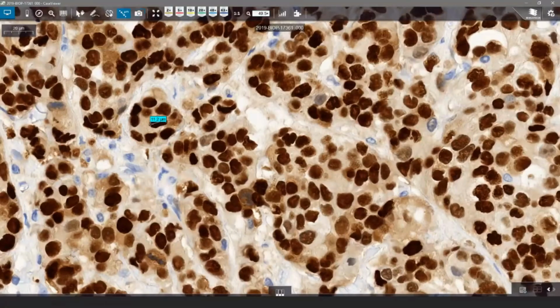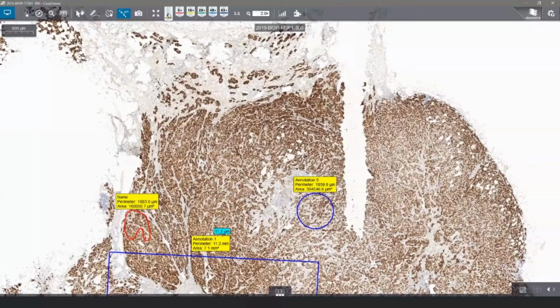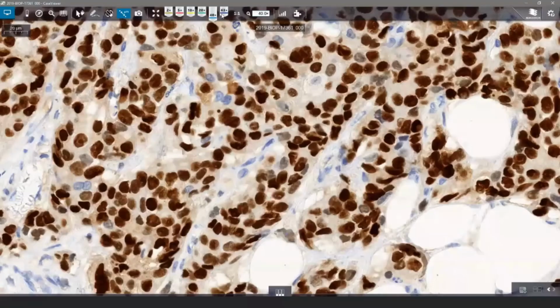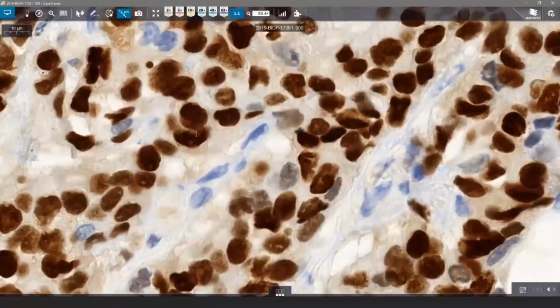The zooming panel has basically three options. The first one is the best fit of the slide. Then you have the traditional buttons for the different magnifications. These are the objective-like buttons. And finally, you have the one-to-one or the native resolution button. Basically, this shows our native resolution.